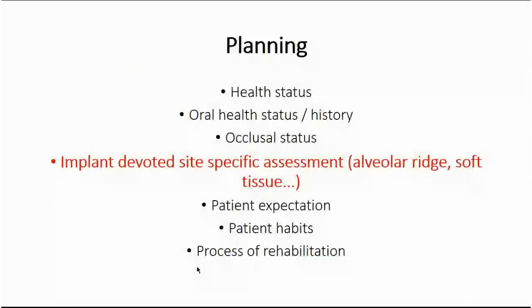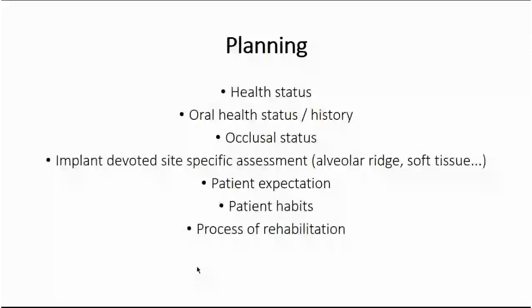So at the beginning, I would like to say that it is necessary not to misunderstand CBCT recordings by themselves and put them in the first place. It is really necessary to put our recordings in the line of all our diagnostic issues, because it will keep us from mistakes.